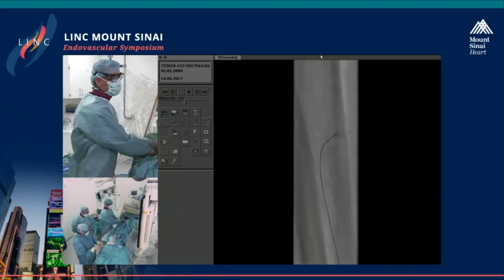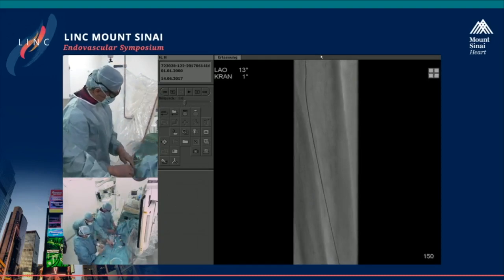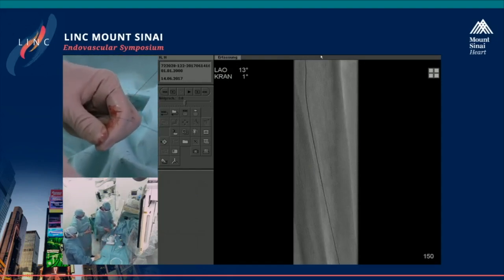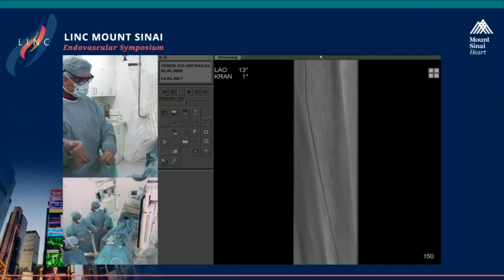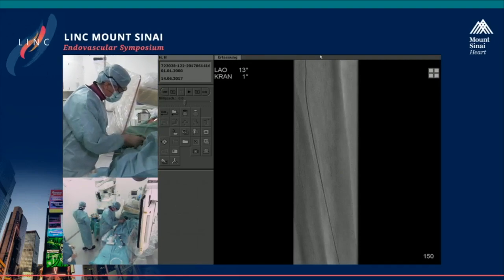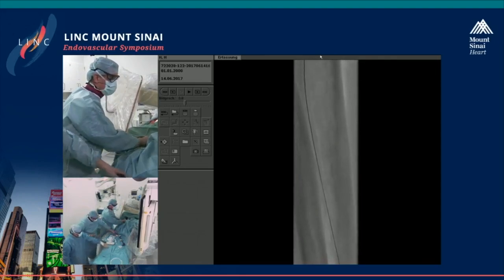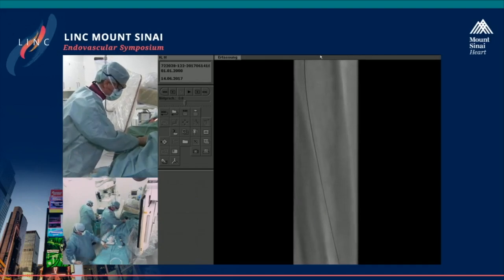Marco, something different? Would you do something different? Okay. So you're using the 018 wire to have more support for inserting a small sheath or support catheters, right? Yeah, exactly. Because the artery is relatively deep in the calf, and as I said, we need a 4 centimeter long needle here to reach actually to the artery from the skin. So in that depth, I think it's better to have a stiffer, more supportive wire indeed.